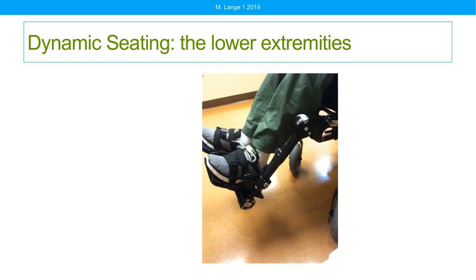When we get to the end of the webinar, I have some resources listed for you, including where you can read those blogs, and there is one that's just on this topic of durability. It's a very important topic because we already have clients that are breaking things on their chair, and these moving components have to be able to withstand a high amount of force and move, which means they have to be stronger than the original components. So durability is a big deal.